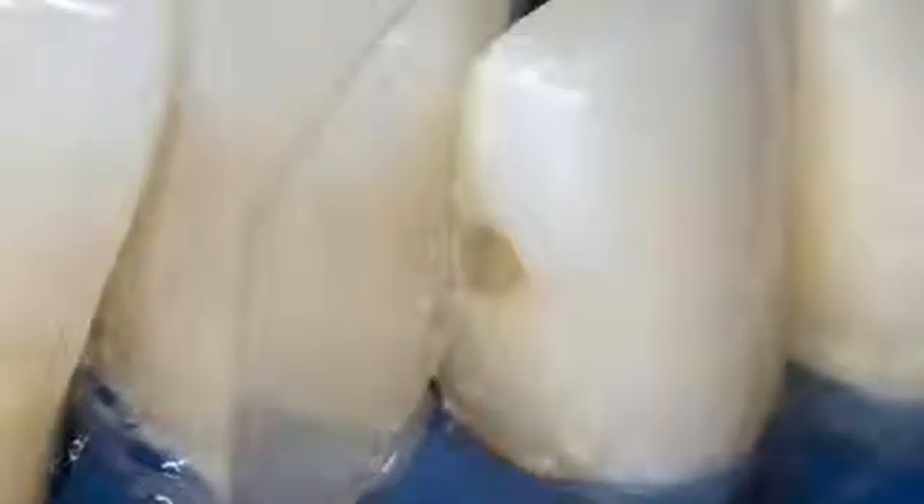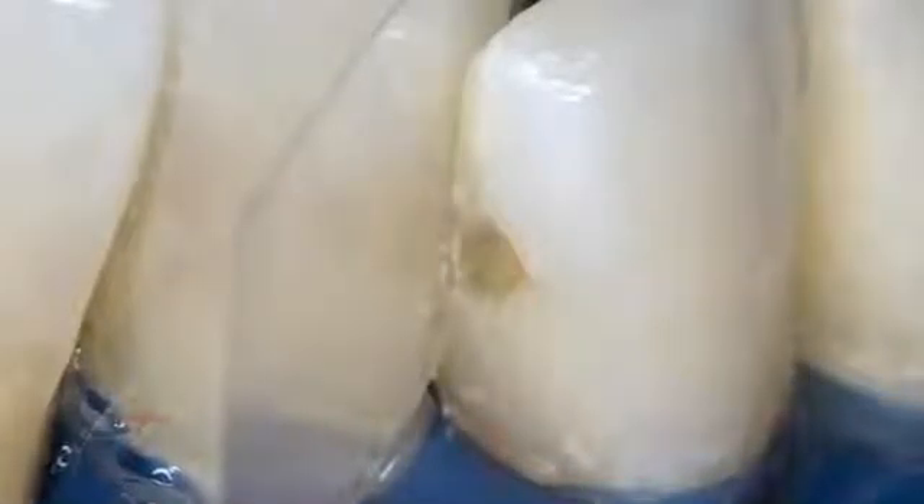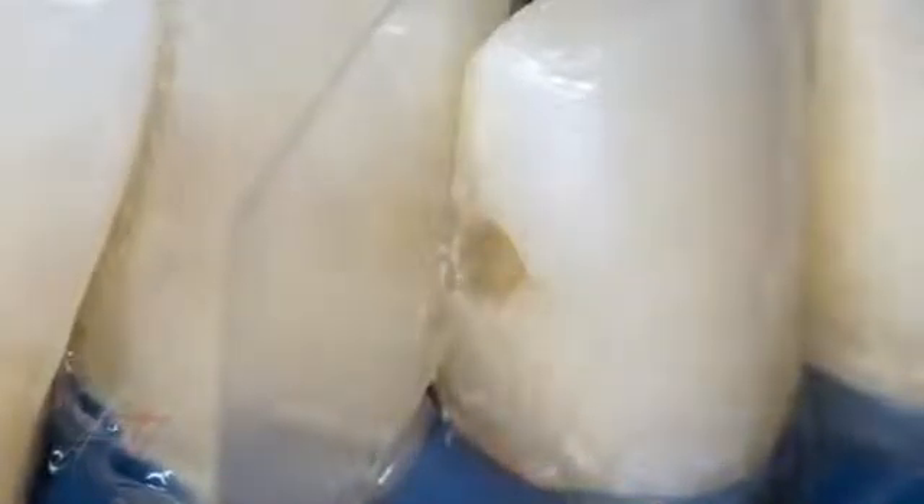The dead metal matrix was replaced with a mylar plastic strip in the interproximal zone to confine and adapt the composite material to the tooth surface. The mylar strip produces a smooth surface while maintaining the anatomical contour during the polymerization process. A bleach-shaded flowable composite material, Genial Universal Flow by GC America, was injected into the preparation and the syringe tip was slowly removed while extruding the material. The mylar strip was firmly adapted to an ideal contour and light-cured for 40 seconds using a ramp mode.